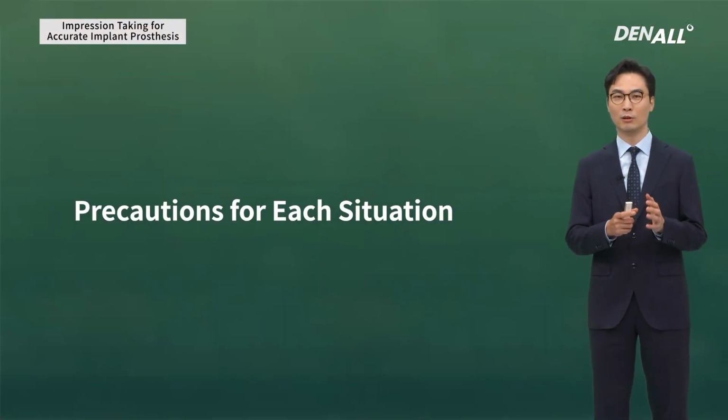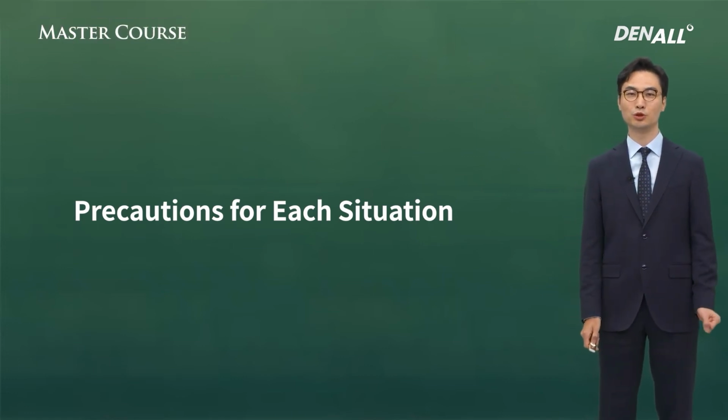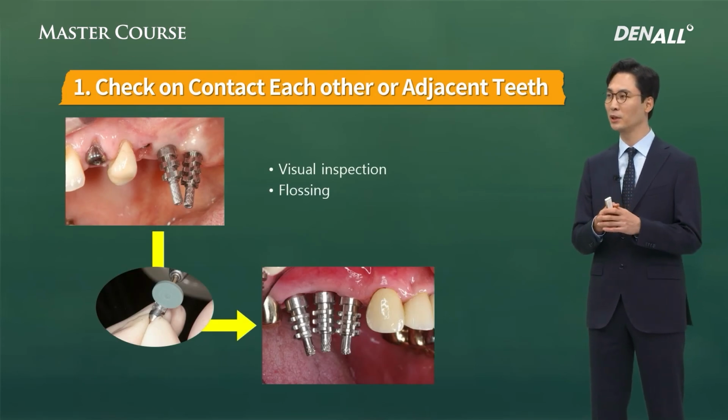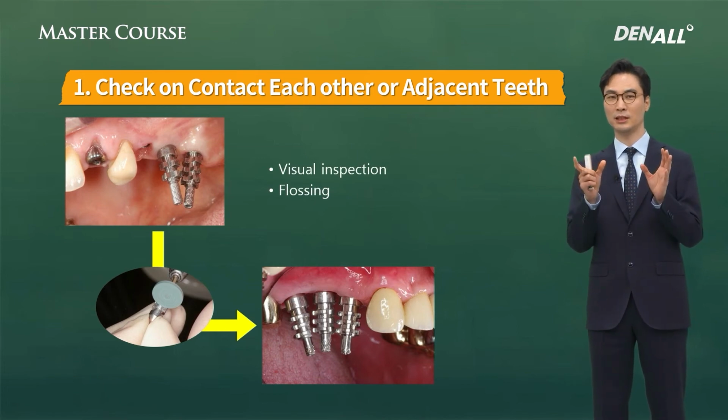I would like to now talk about precautions for clinical situations where we use abutment level, implant level, transfer coping, and pickup coping. Regardless of whether it is pickup coping or transfer type coping, there can be cases where copings are in contact with one another.